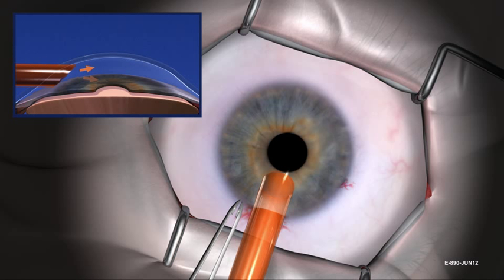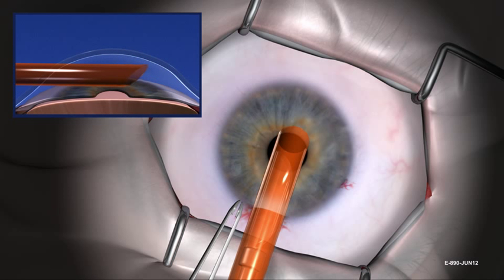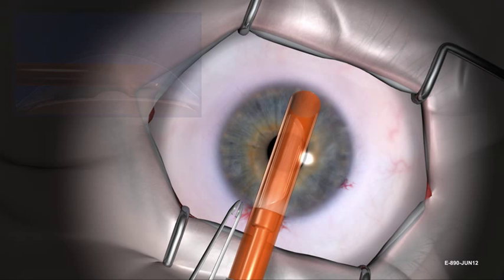Start and continue irrigation with the bottle height at 40 centimeters. If necessary, deepen the chamber by slowly raising the bottle height while irrigation continues to flow. Continue irrigation as the device is moved across the anterior chamber past the far edge of the stripped stromal bed.